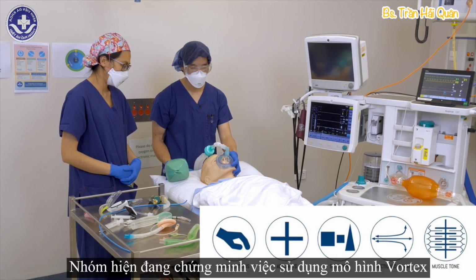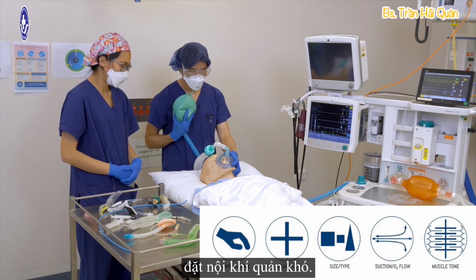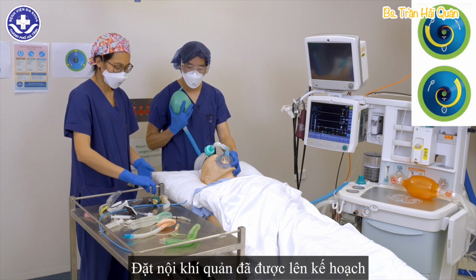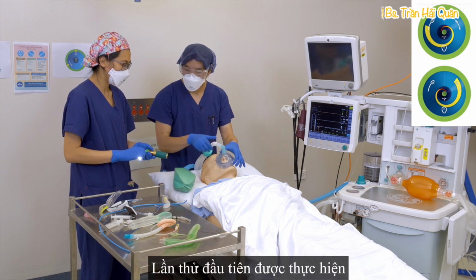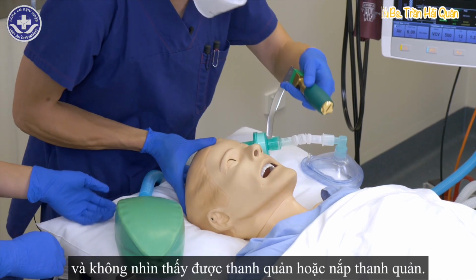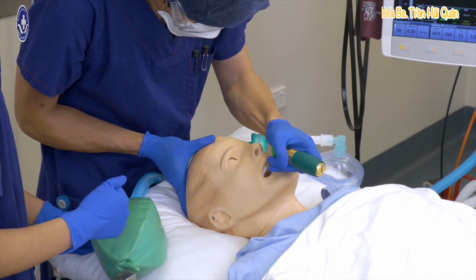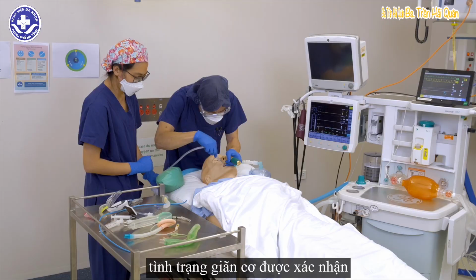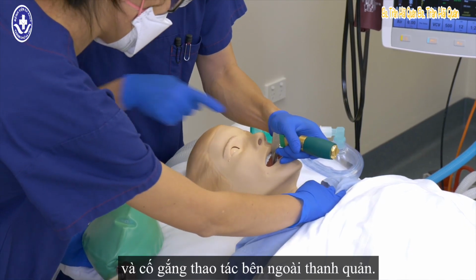The team are now demonstrating the use of the Vortex model to help make decisions during a difficult intubation. Endotracheal intubation has been planned as the primary airway technique for this patient. A first attempt is made using a curved Macintosh blade, and there is no view of the larynx or epiglottis. Suction is used to clear the airway. Paralysis is confirmed, and external laryngeal manipulation is attempted.